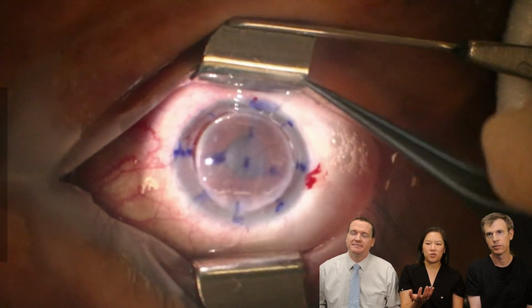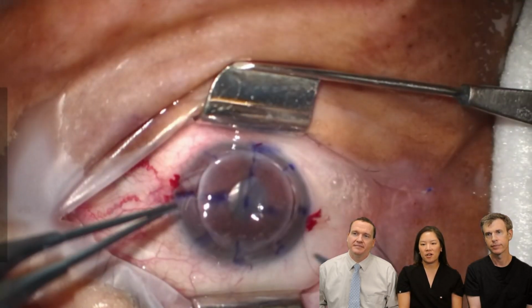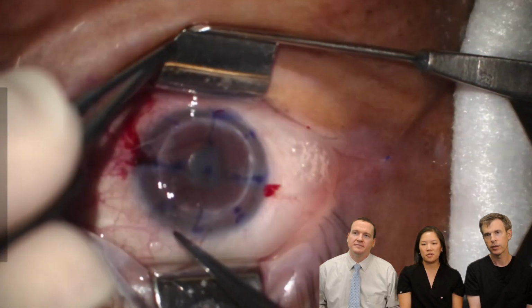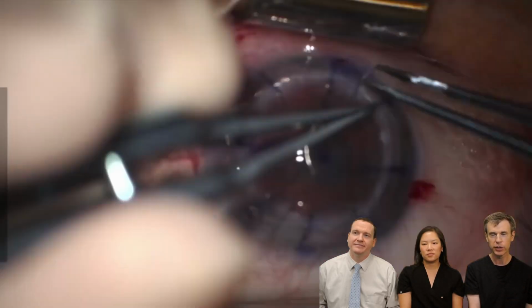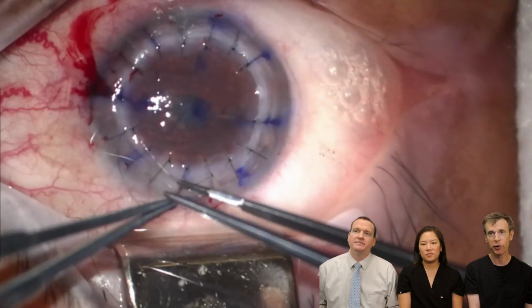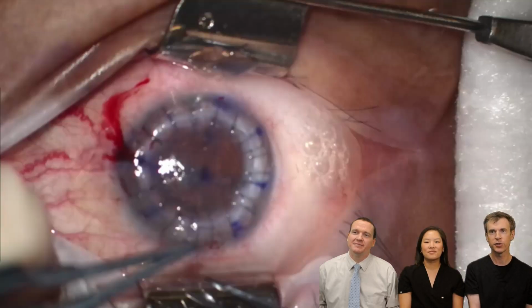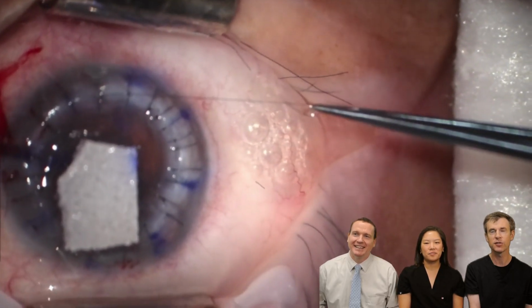You'll actually see the vitreous and the lens pulsate with every beat of the patient's heart as you're operating. So you can really tell that there is some real posterior pressure that can happen. Without any irony, we call the first 4 the cardinal sutures, because once they're in, we get much more comfortable, but more certain that this surgery will have a good outcome, because the blood pressure goes down. Yes. Because the chances of things going the wrong way are now down. And people always ask me, how many sutures are there in? And my answer is usually as many as it took to get this to safe. And you see this is a pretty large transplant.